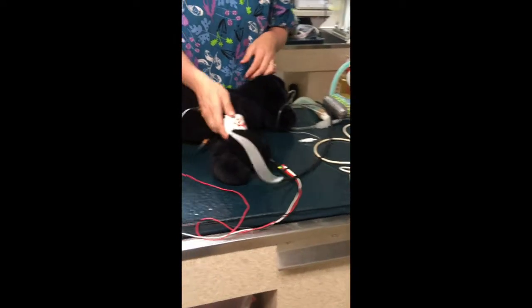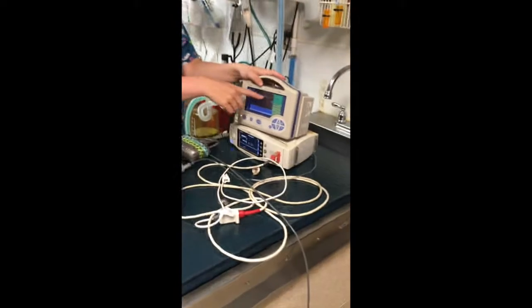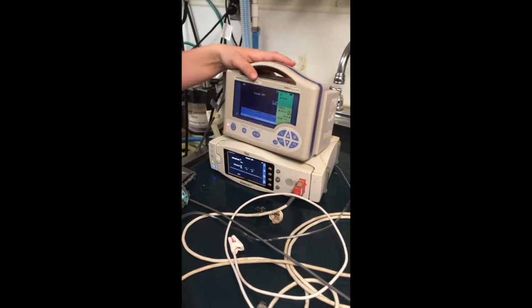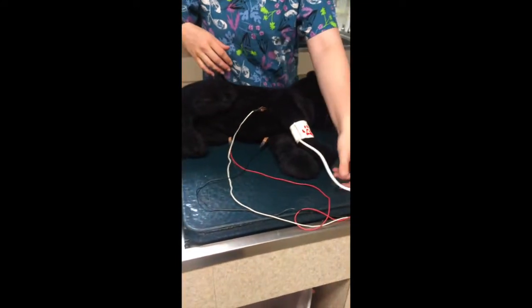Next we have our blood pressure cuff. Back to ECG. Our heart rate is displayed on the monitor. These leads hook up to the monitor, and we'll display heart rate and also display a tracing of the heart rate, so you can see if anything's happening with the tracing.